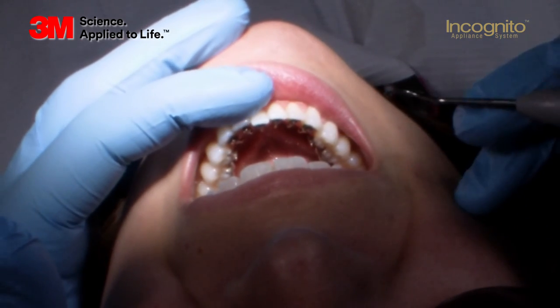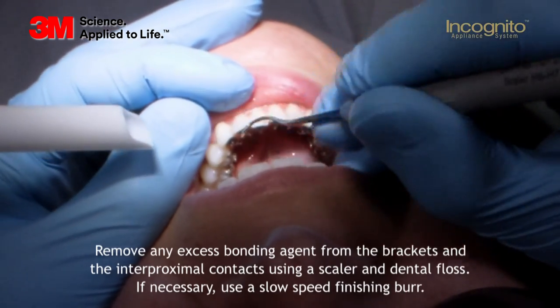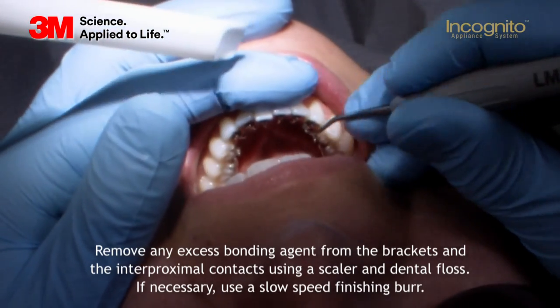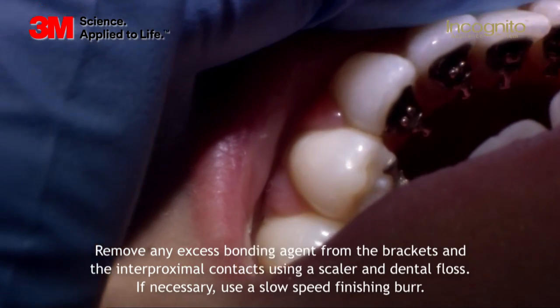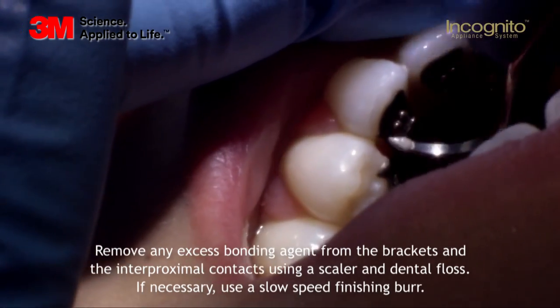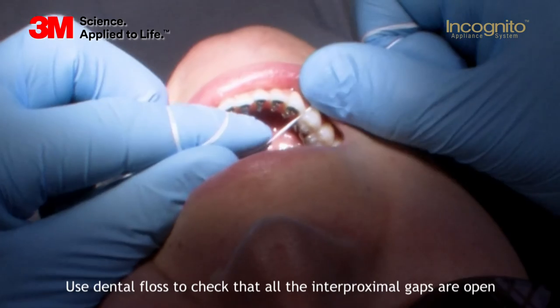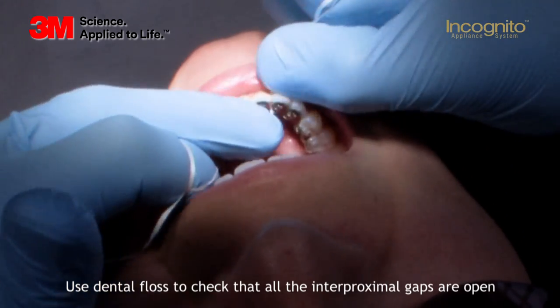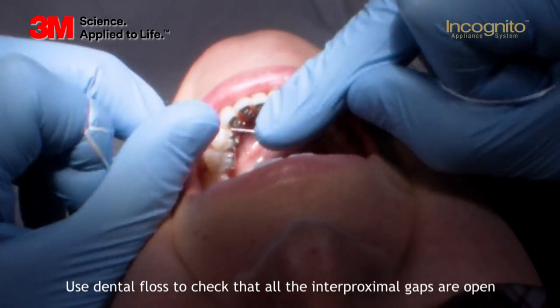After having bonded all the brackets on the teeth, we have to make sure to remove all the excess on the surfaces. As you can see here, there is hardly any excess glue. I always go through the interproximal area just to double-check that we have no glue in the contact areas, as any glue in there will prevent the teeth from moving. Having done that, we have to make sure that all the contact points are clear.